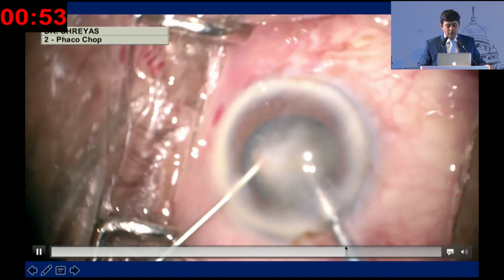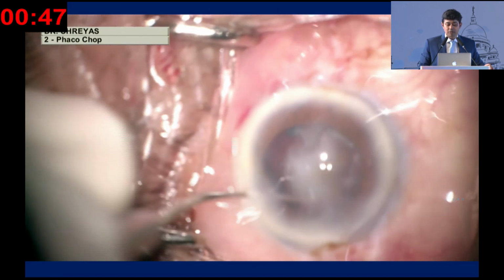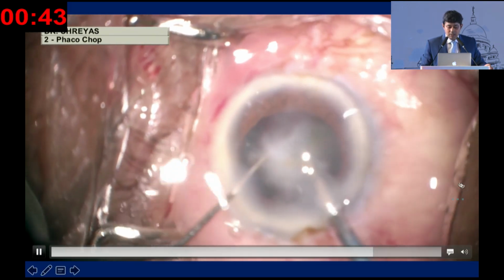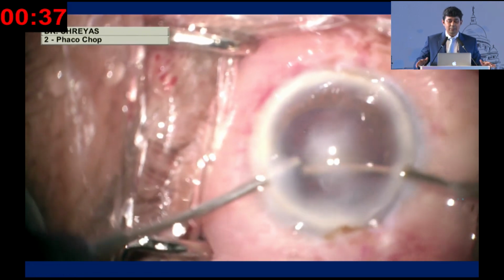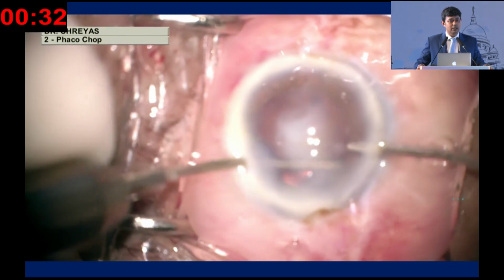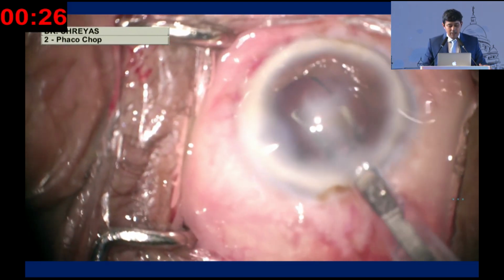Just be careful that you're again doing it in the area of visibility. These patients, although they have scarring, their endothelium itself is not really compromised, and you can go ahead with a very safe emulsification and end up with very good results. The idea is not to really deliver 6/6 results. It's to ensure that the patient has a 6/36 or a 6/60 for the rest of their life, rather than have a 6/9 for just a year or so and end up with a failed vascularized graft like the patient has in the other eye.